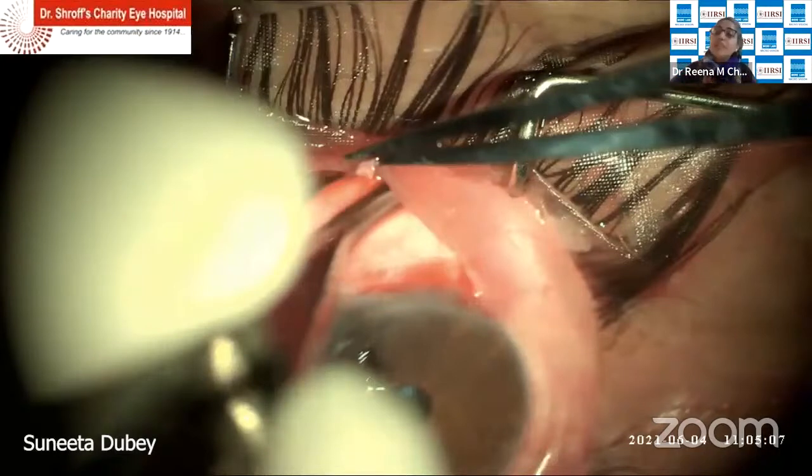I like to place at least three to four sponges, depending upon how large your conjunctival edge is. I don't like to do the side cuts. But when you're putting the sponges, you try and cover a larger area so that your bleb is more diffuse and more posterior. I think that is very important. And as Dr. Madhu mentioned, counting is very, very important. Whether you're putting three or four, it has to be counted, otherwise there's a possibility of leaving one behind.